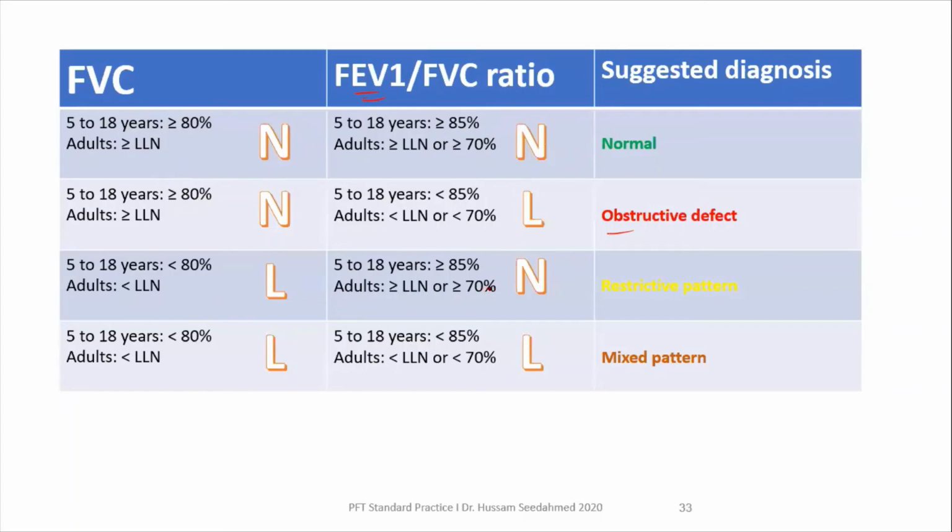but the ratio is normal, دي معناته انه both of them they decreased اللي هي the FEV1 والاف في سي. وقلنا نقصان الاف اي في 1 ما معناته انه the airways are obstructed، لا، because of the decrease of the total cross sectional area of the lung, because restrictive lung disease usually it includes small lungs, so this indicate restrictive. اما اذا لقيت الاف في سي low والريشيو برضه low, this is a mixed pattern.